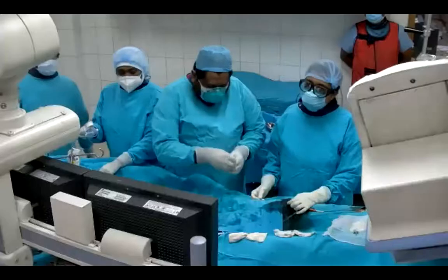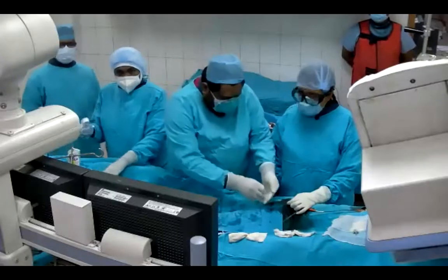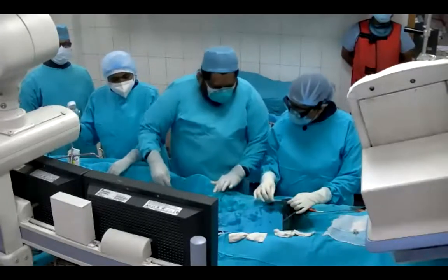There is another question from the audience. Because the patient has CKD, could mini crush be a better option to avoid more dye and more time? All studies have shown that DK crush is more effective than mini crush for long-term results. As we have noticed, this patient has CKD, so we want to give him the best possible long-term outcome. As you have rightly pointed out, mini crush is easier than DK crush, but DK crush will give you better long-term results. That is what the studies show.